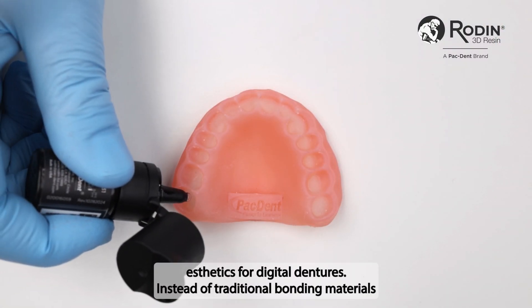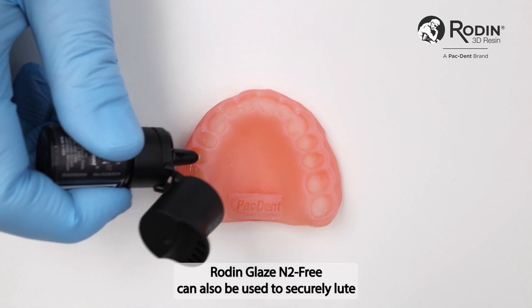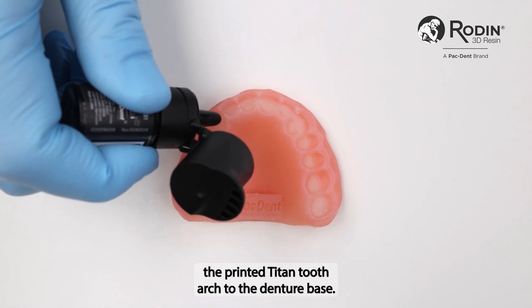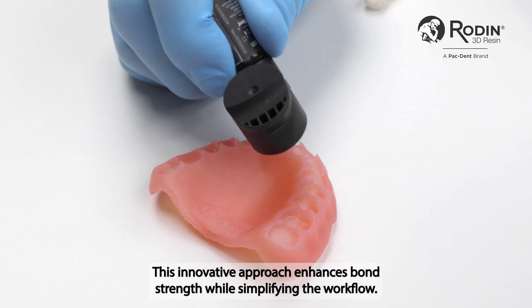Instead of traditional bonding materials, Rodin Glaze N2 Free can also be used to securely bond the printed Titan tooth arch to the denture base. This innovative approach enhances bond strength while simplifying the workflow.